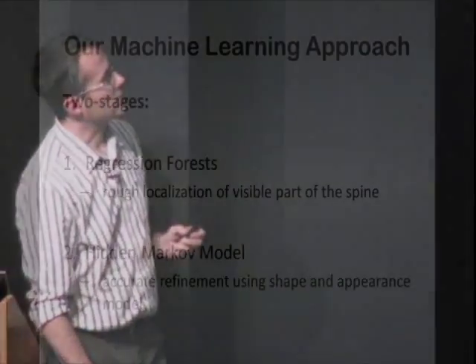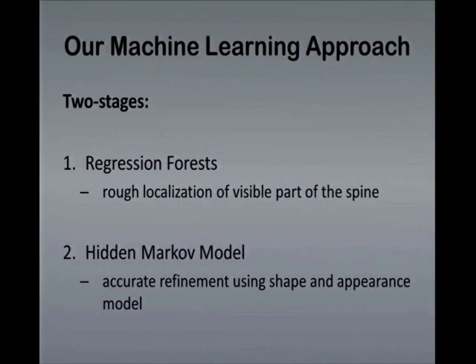Once again, in the case of a PACS retrieval system, as we were describing earlier, this can also be extremely interesting. If the computer knows this ahead of time, you can do a lot of good in terms of a more adaptive, selective retrieval of the images. So what we do is we use a different type of decision forest. In this case, it's called a regression forest.